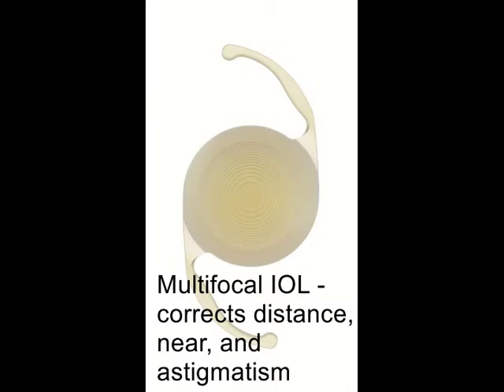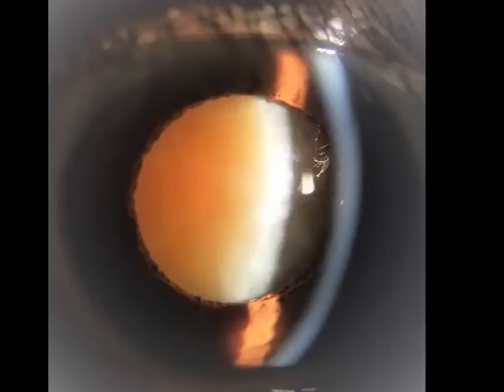Multifocal IOLs can correct astigmatism and give you near and far vision without necessarily resorting to glasses. Before surgery, we measure your eyes to ensure that we place the correct IOL to get you the result that you desire.